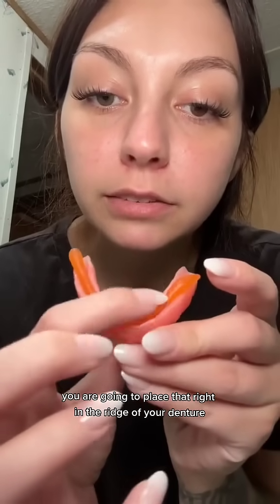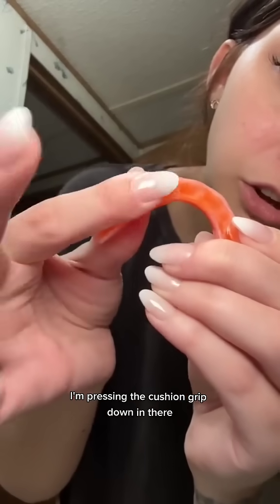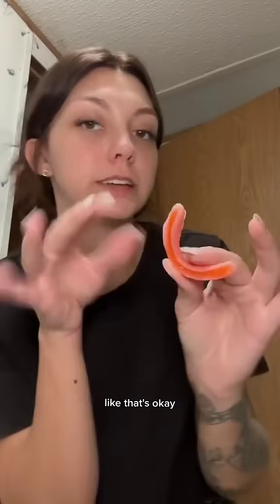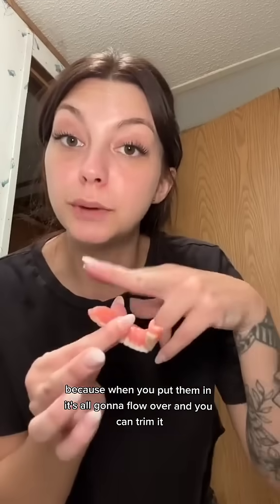You are going to place that right in the ridge of your denture. I'm pressing the cushion grip down in there. It's all right if there's some extra — it might seem like it's too much, but when you put them in, it's all going to flow over and you can trim it.